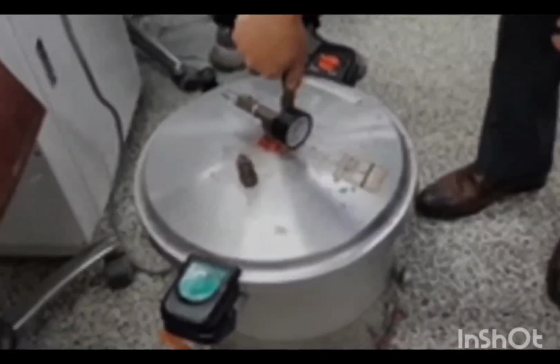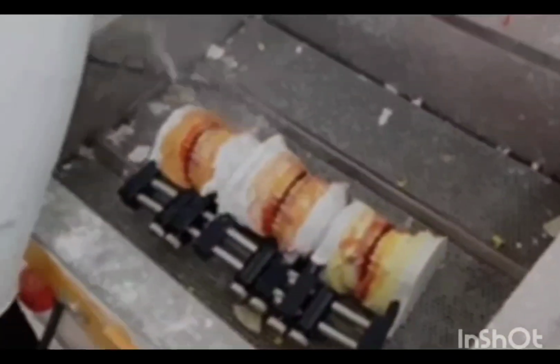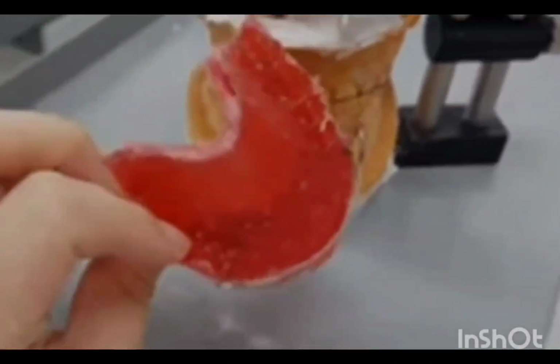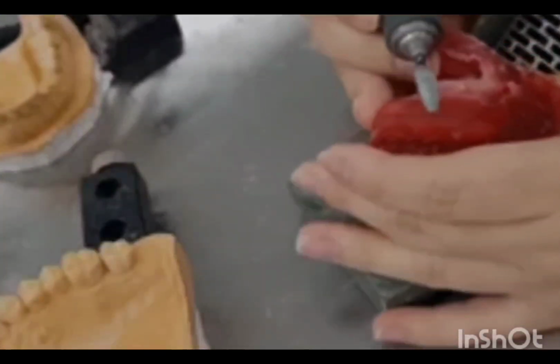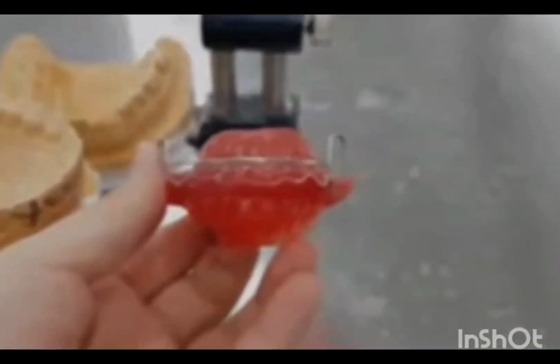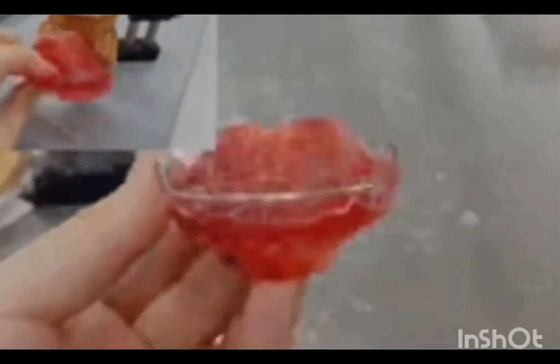After acrylization, this is how the appliance looks. Now we pour hot water for dewaxing and easy separation of the appliance from the cast. This is how it looks now. The next step is to trim the appliance. All the excess acrylic is removed and a particular shape is given to the appliance. This is how it looks post trimming. Now you can compare it to the window on the left side, how it looked before trimming and how it is after trimming.